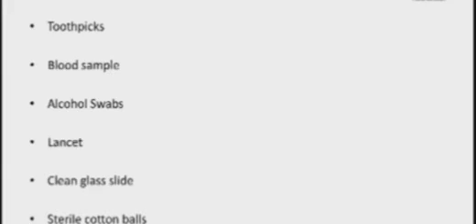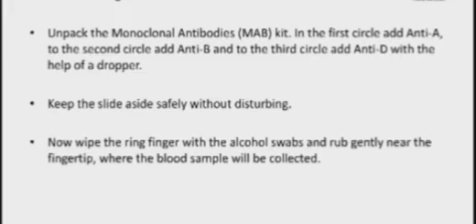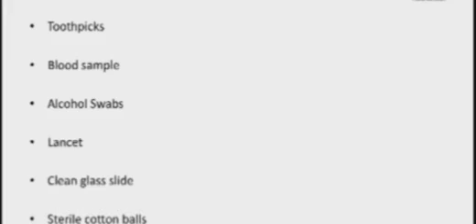The materials required for performing the experiment are: three toothpicks, a blood sample, alcohol swab, lancet, clean glass slide, sterile cotton balls, and monoclonal antibodies — that is anti-A, anti-B, and anti-D. The monoclonal antibody kit consists of three solutions: anti-A antibody solution, anti-B antibody solution, and anti-D antibody solution. Anti-D basically determines the RH factor, that is whether your blood group is positive or negative.